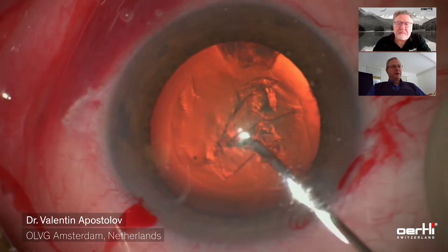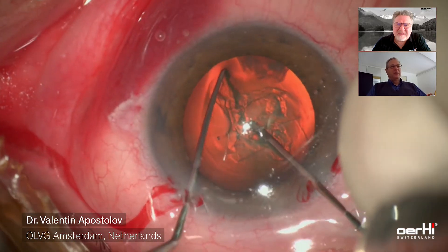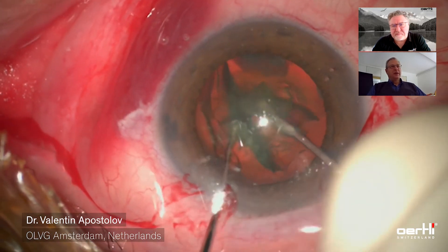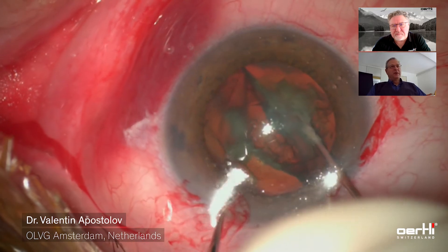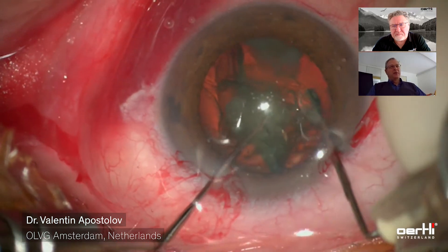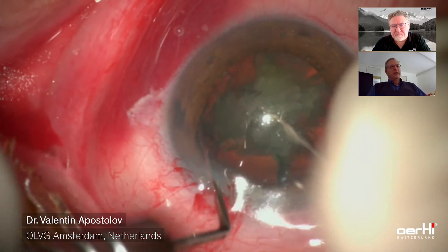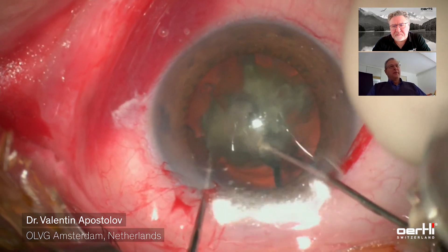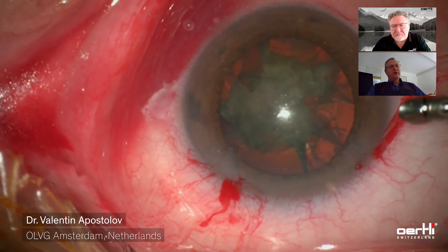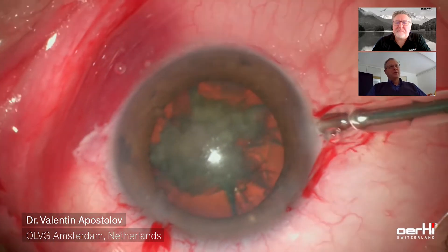I felt the nucleus with the cystitome — it was a moderately hard nucleus, so I decided to do pre-chopping. The pre-chopping is done with the cystitome and the chopper. I omitted the hydro dissection, and it's quite possible to do it that way, because when displacing the fragments, you actually get cleavage between the nucleus and the cortex and the capsular bag as well.